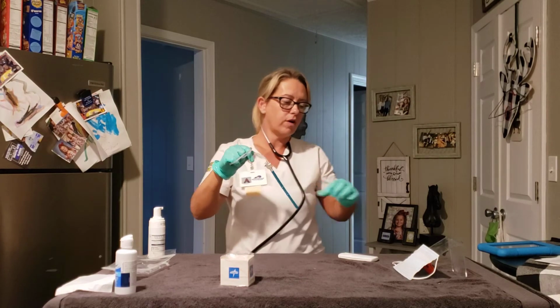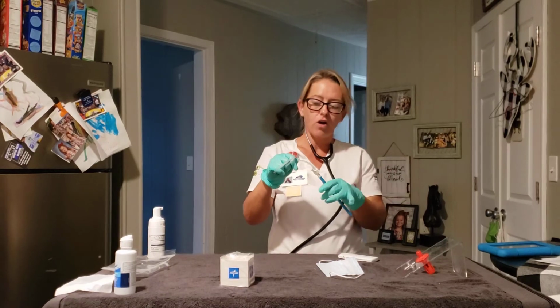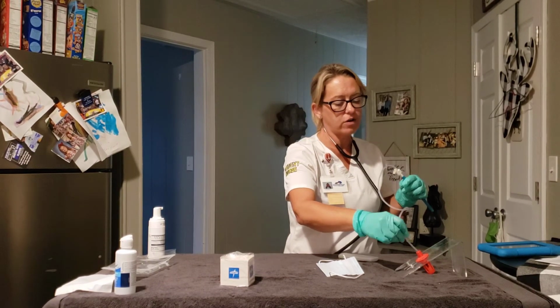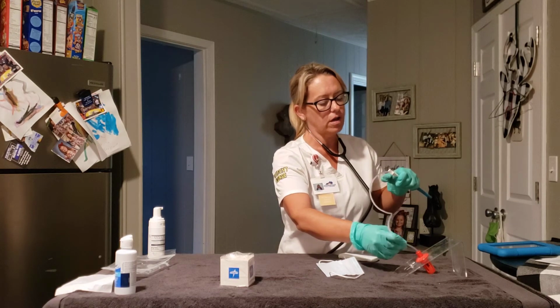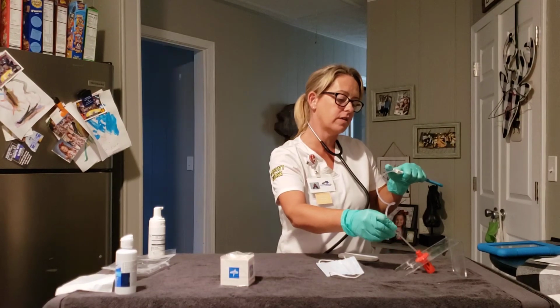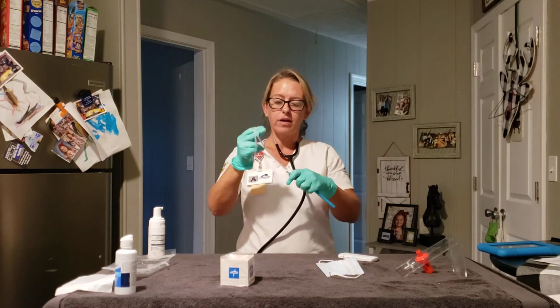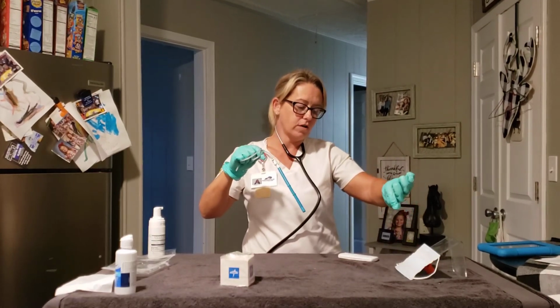Okay, I'm going to remove her mask. I'm going to tell her this is going to be just a little bit uncomfortable. It's going to make her cough. I'm going to feed it with my fingers until I meet resistance or the patient coughs. And she is coughing, so I'm going to pull out with immediate suction. Okay. At this time, I'm going to go ahead and put this back on her for oxygen.